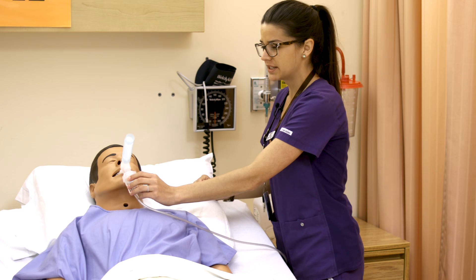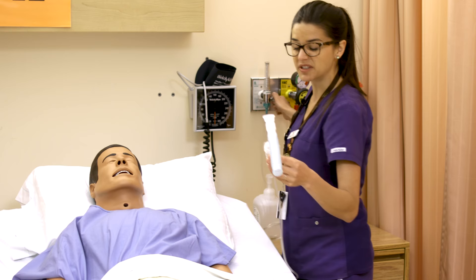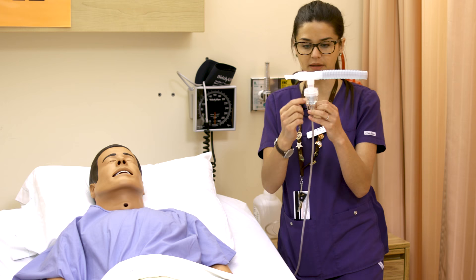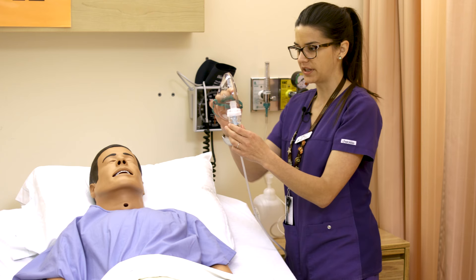This is where you would ask the patient to hold the mouthpiece and take full, deep breaths to really inhale the medication and get it deep into the lungs. This is going to take about ten to fifteen minutes to complete. When you return and it's done, you'll notice there is little or no medication left in the canister.